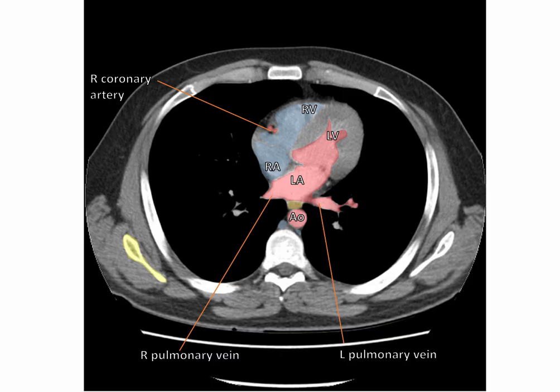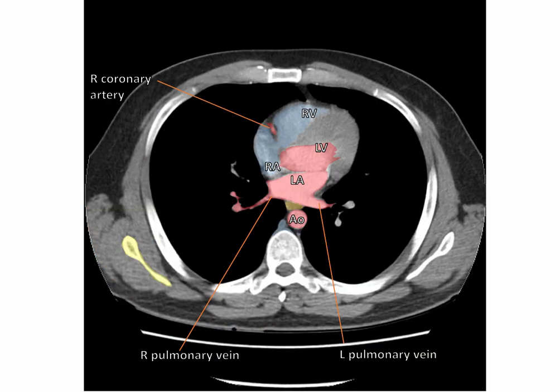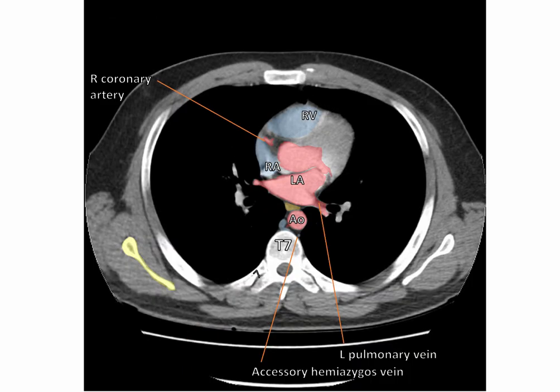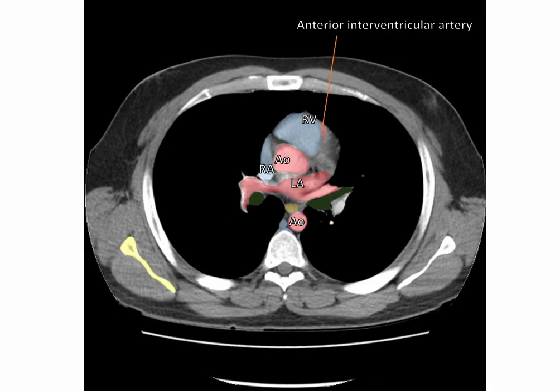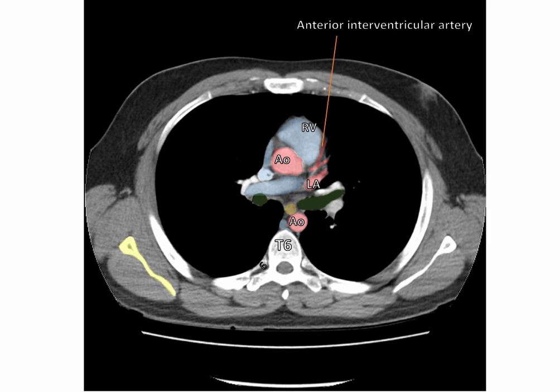We can also see some of the axio-appendicular muscles at this level. Here is the trapezius, here is rhomboid major, here we have serratus anterior, and here latissimus dorsi. Highlighted in green, we have some of the rotator cuff muscles. We are now at the so-called high cardiac level. The small vein on the left is the accessory hemiazygous. We are now beginning to see the right and left main bronchi, highlighted in green. The left ventricle has narrowed to form the aorta, and branching from it we can see the right coronary artery. We are also beginning to see the profile of the anterior interventricular artery, also known as the left anterior descending artery, running in the interventricular sulcus, and now we can see its branches from the left coronary artery with the circumflex artery.